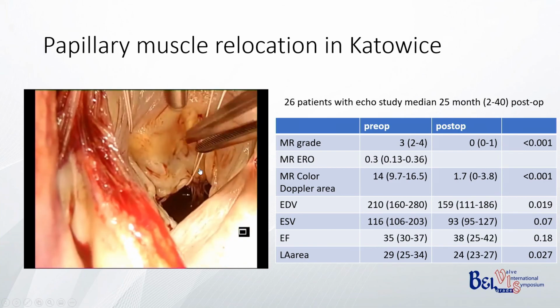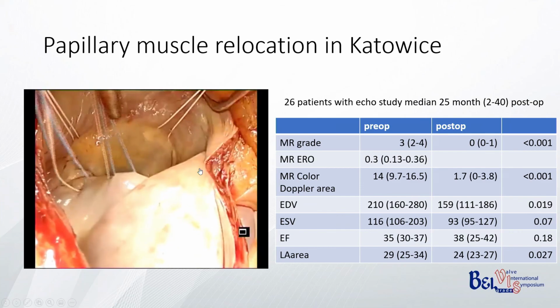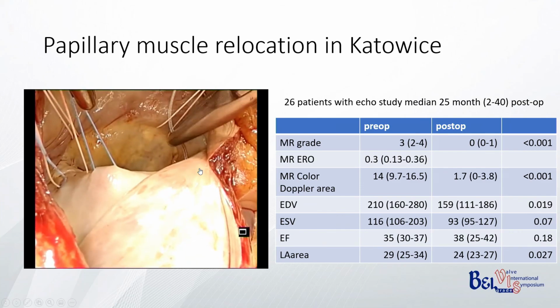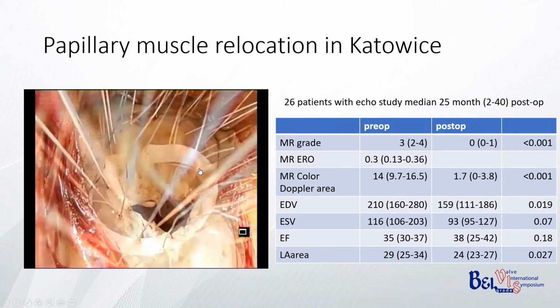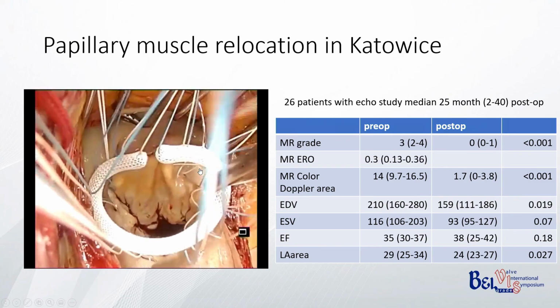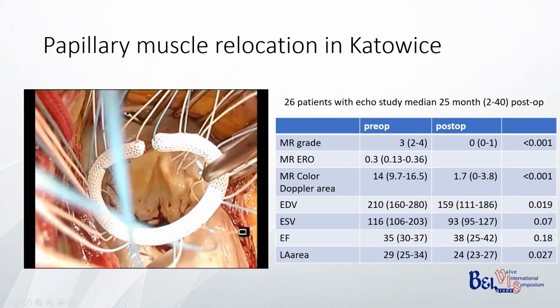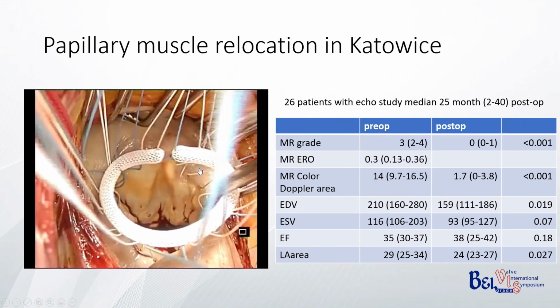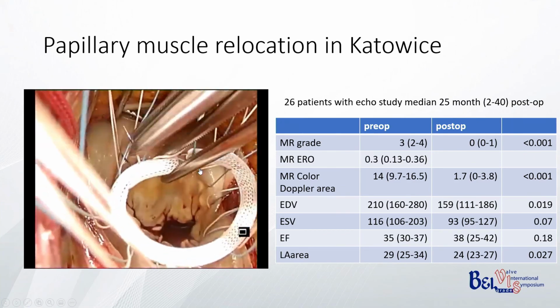And then you add normal annuloplasty and pass the stitches via the prosthetic annulus. So this is to support your stitches. You see we measure 32, so we don't downsize in these situations as much as we would downsize for the normal procedure where you do annuloplasty alone.